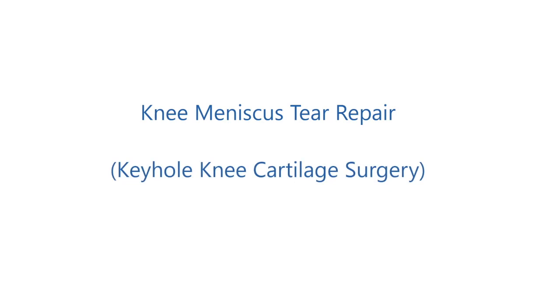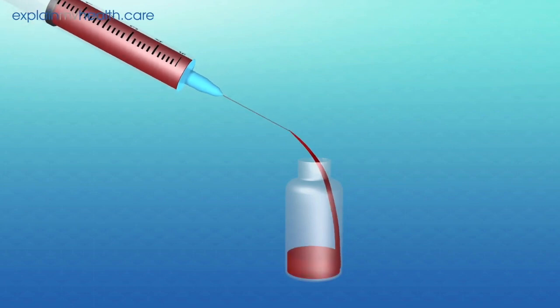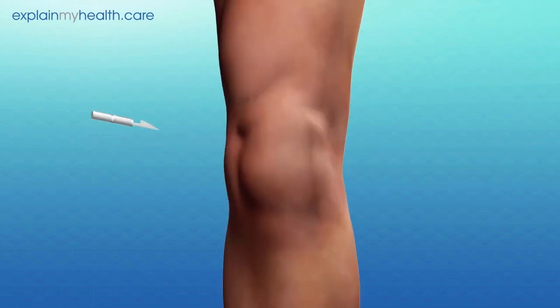You're watching this video because a surgeon recommended an arthroscopic meniscus tear repair, also known as keyhole knee cartilage surgery. The purpose is to reduce pain and restore function to the knee joint. This method of repair involves taking a blood sample to form a blood clot that is used to aid the healing process of the meniscus.